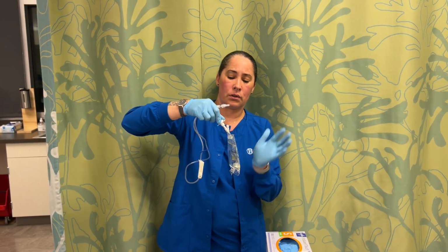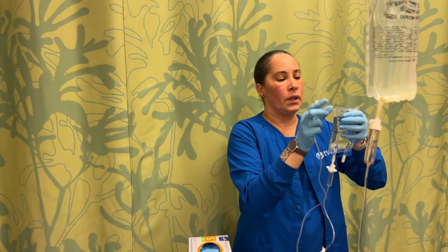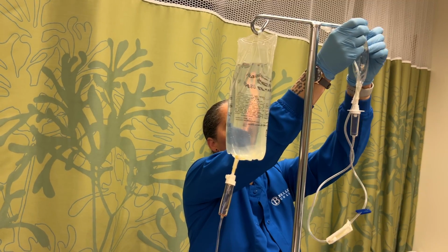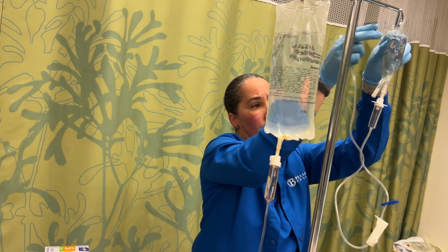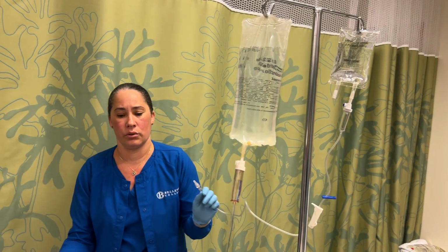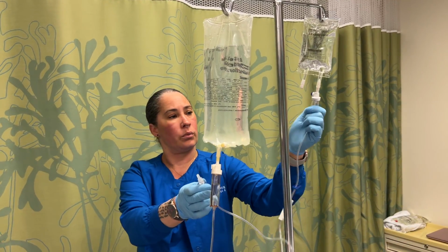Same thing with this one. You're going to want to make sure that you get it all the way in and not poke the sides and put a hole in it. So this is now going to hang here. And to get this to flow before this, we're going to have to do a little trick. But first you want to prime the tubing. So we're going to prime the chamber just the way we did that one.